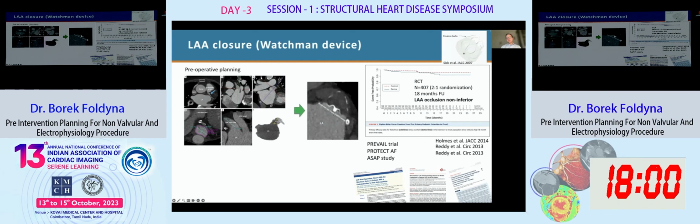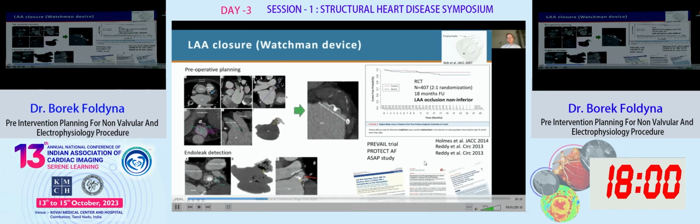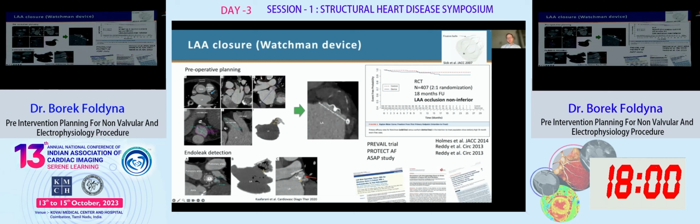And as you can see here on the right, this is after the implantation. Here we can see the Watchman device with this covered part here in the beginning, and then the uncovered bare springs here, fully thrombosed as it should be. The postoperative imaging focuses on the detection of para-device leakages, as you can see in this example here.